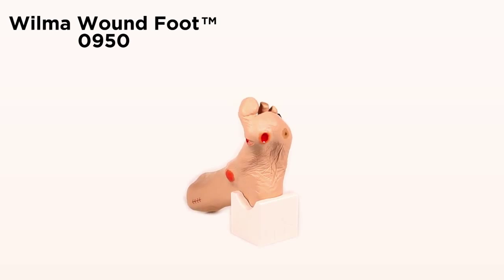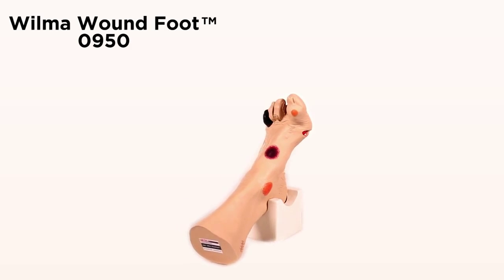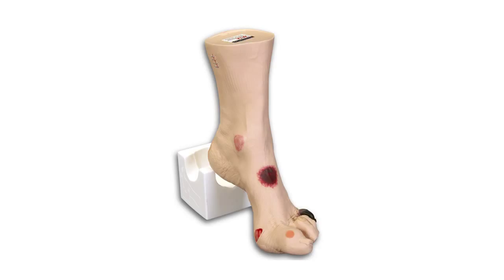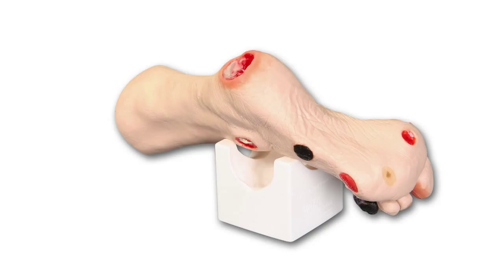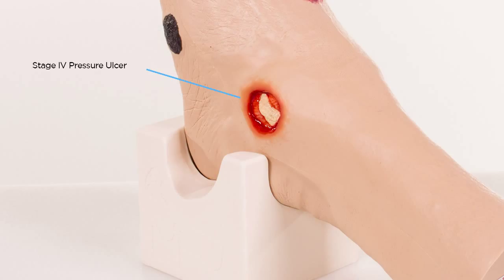Wilma Wound Foot Model 0950. Wilma Wound Foot displays 20 different conditions. For pressure ulcers, there is a Stage 1 on the medial malleolus, Stage 2 on the lateral part of the foot, Stage 3 on the heel, and a Stage 4 over the lateral malleolus displaying bone with osteomyelitis and tendon. On the medial aspect of the foot, another Stage 4 with exposed tendon and slough.